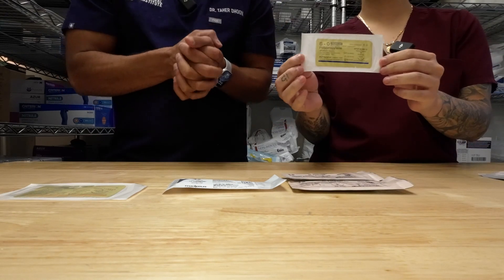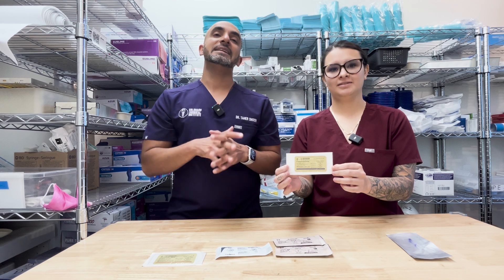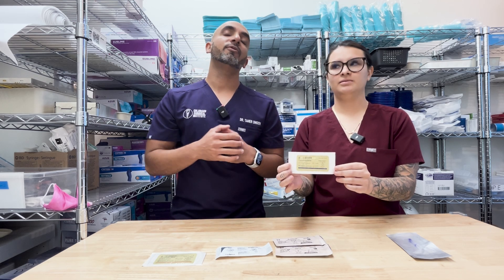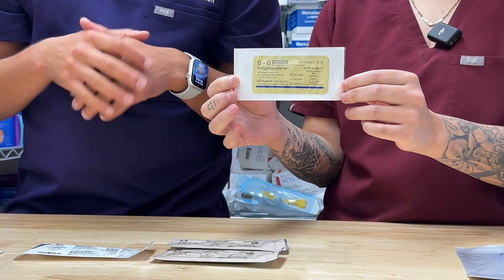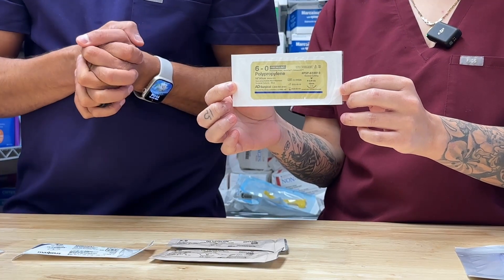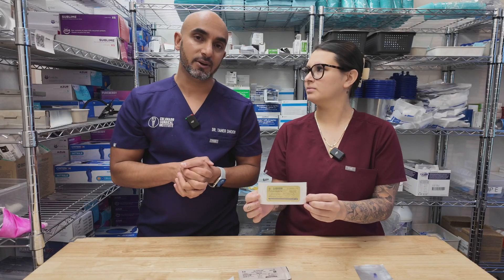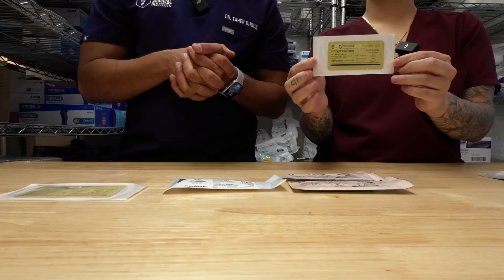My least favorite, but one that still has its place, is the 6-0 polypropylene. This is non-resorbable and very thin — it's going to be more for your tissue grafting cases. So if you're doing connective tissue grafting, free gingival grafting, anything like that, that's where I use it. I tend not to use it in other places, maybe if I'm removing a lipoma or any type of lesion from the lip and suturing a very fine area — then I would use that.